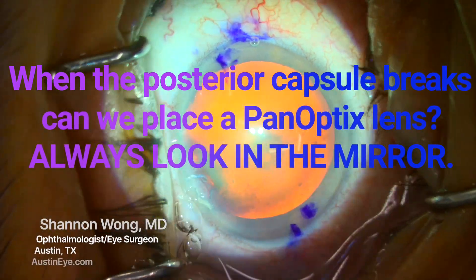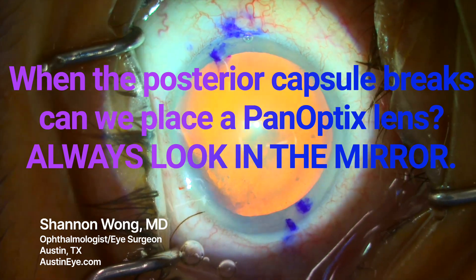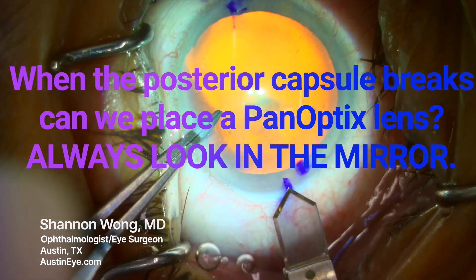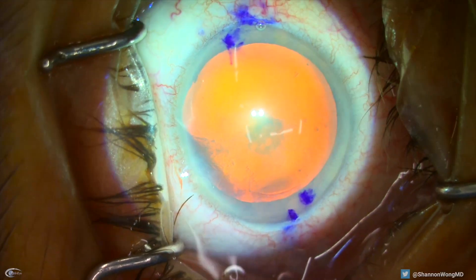When the posterior capsule breaks during cataract surgery, can we still place a panoptics lens? Always look in the mirror. This is a great case with several great teaching points.